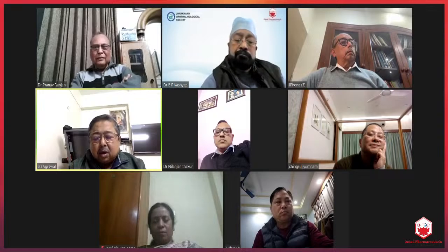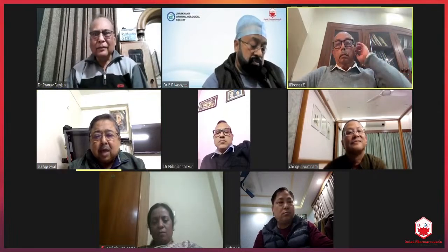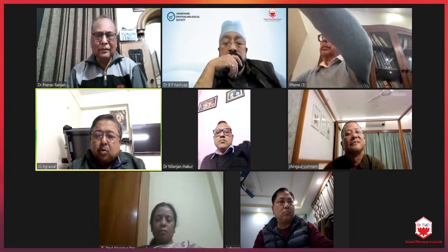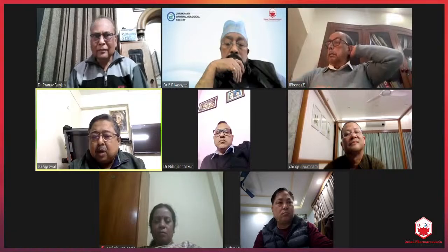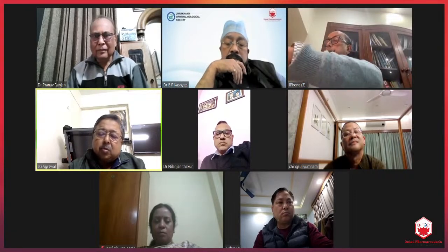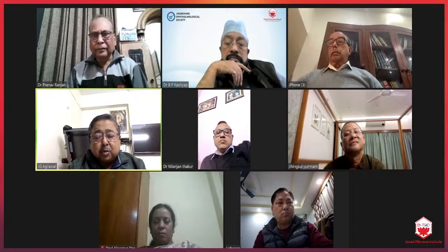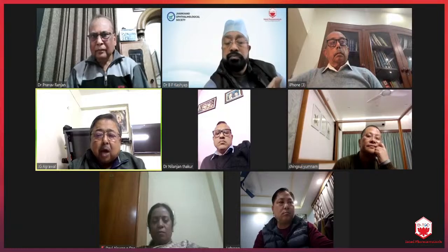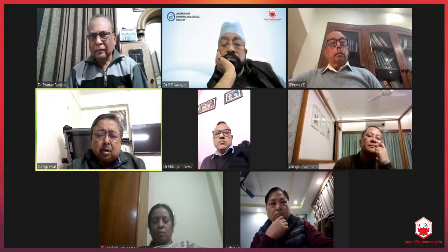We are going for newer formulas like Barrett's and EVO, Kane, and other artificial intelligence-based formulas, because these formulas are more accurate than others. And also we should avoid those formulas, especially the regression formula. And another point is that we should use those formulas which are not dependent upon the expected lens position. Because these two things are very problematic for the calculation of the IOL. So Barrett, though a slight regression aspect is there, how it is calculated is not known to everybody because it is totally not mentioned by Professor Barrett.